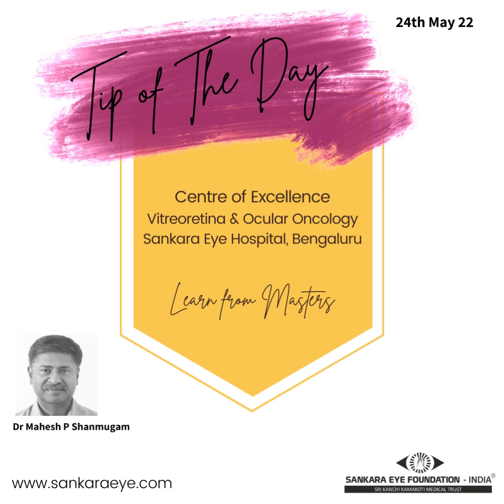Let us look at some basic facts about vitreous engine and instrumentation. The widely used vitreous cutter is a pneumatic guillotine vitreous cutter. The forward and backward guillotine movement of the cutter is driven by compressed air or gas.